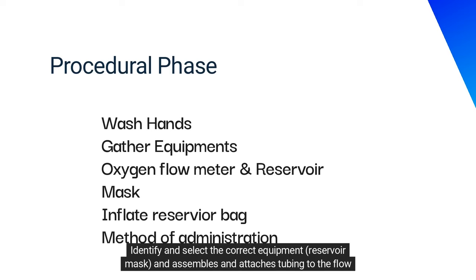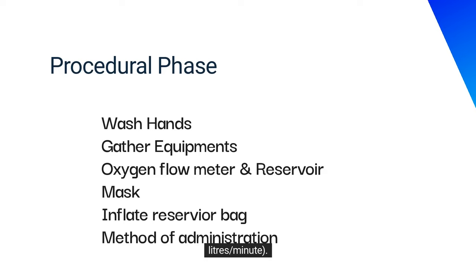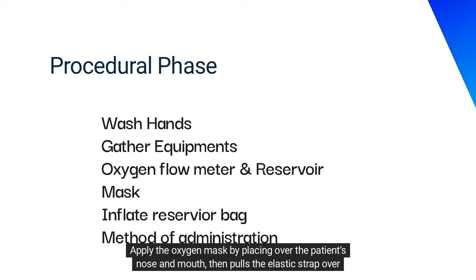Identify and select the correct equipment — the reservoir mask — and assemble and attach the tubing to the flow meter. Turn the oxygen flow meter on, selecting the correct flow rate of 15 litres per minute. Cover the one-way valve with fingers until the reservoir bag is fully inflated.